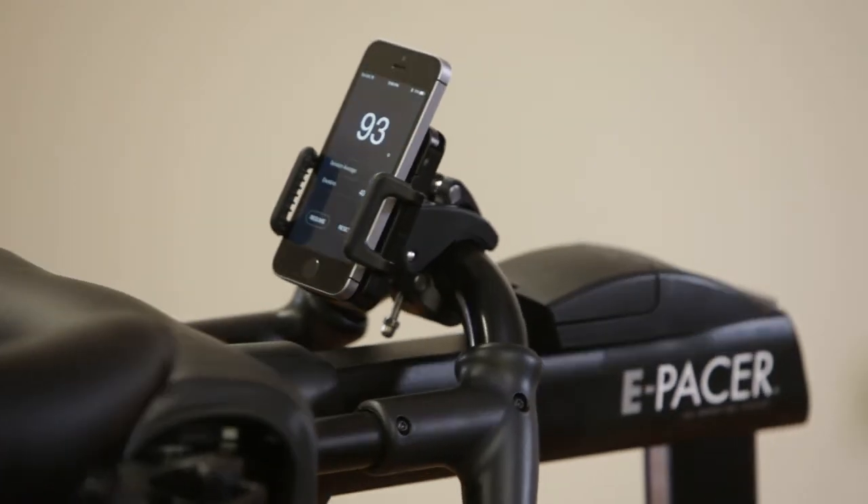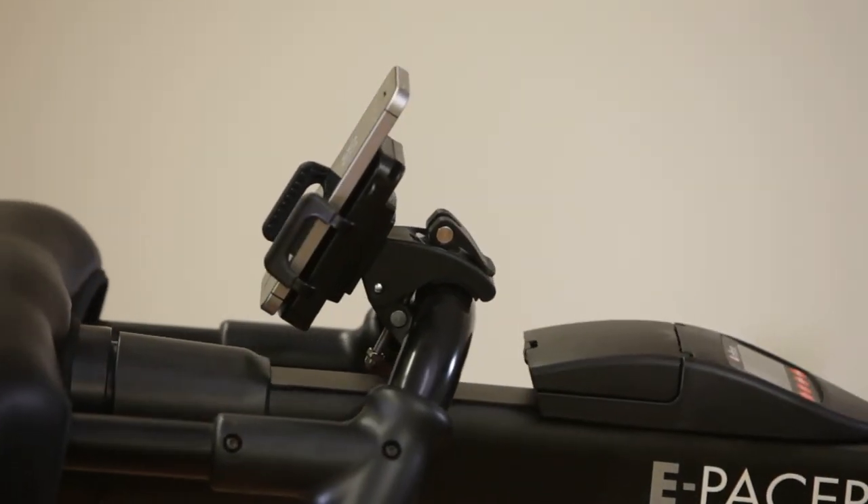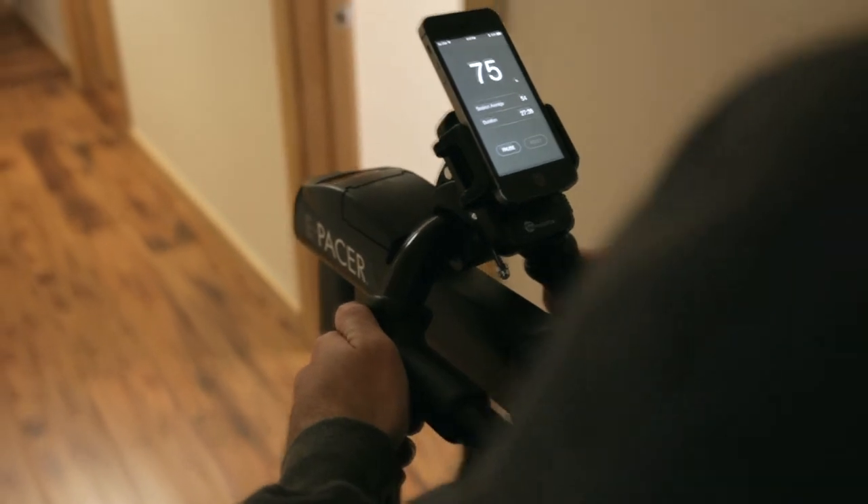A phone can be mounted on the tram or ePacer with a bicycle phone mount, making the scale visible to the client.